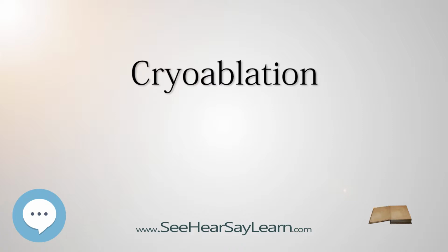Cardiac. Another type of cryoablation is used to restore normal electrical conduction by freezing tissue or heart pathways that interfere with the normal distribution of the heart's electrical impulses. Cryoablation is used in 2 types of intervention for the treatment of arrhythmias: 1. Catheter-based procedures and 2. Surgical operations. A catheter is a very thin tube that is inserted into a vein in the patient's leg and threaded to the heart, where it delivers energy to treat the patient's arrhythmia.